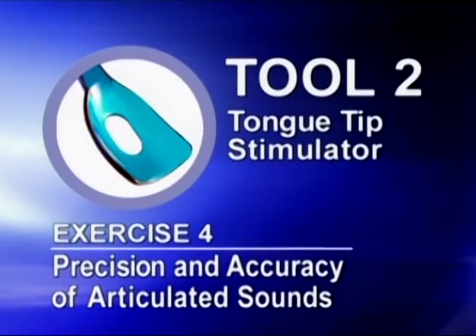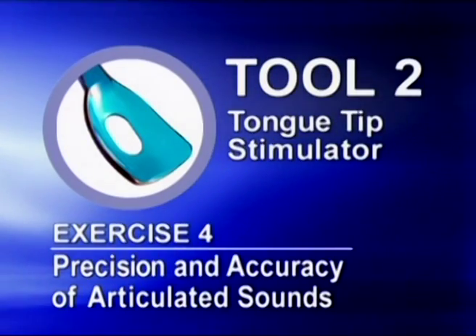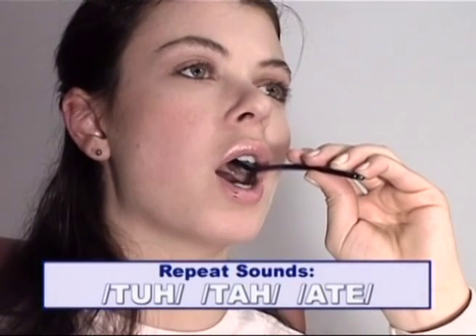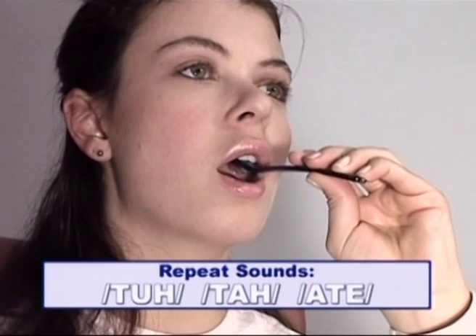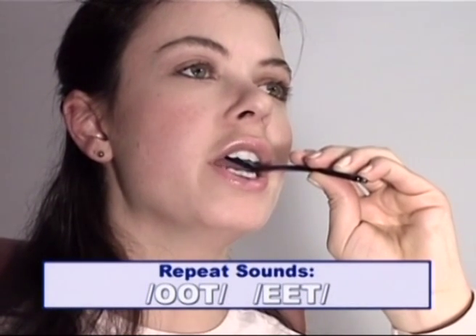The goal of exercise protocol 4 is precision of movement. Place tool number 2 on the palate behind the front teeth. Elevate the tongue tip in the hole opening and repeat the following sounds. Ta, ta, eight, oot, eat.